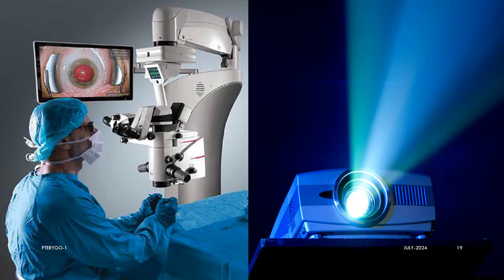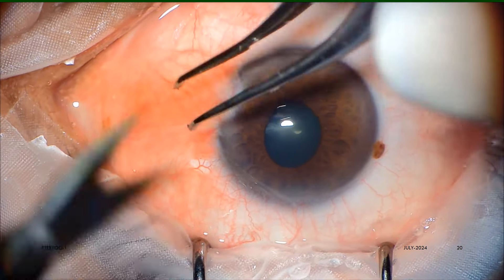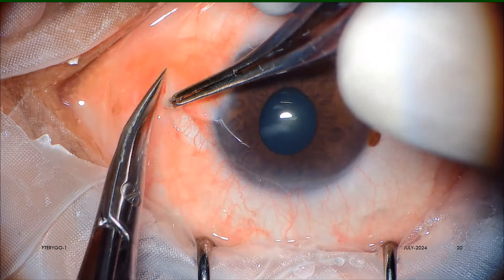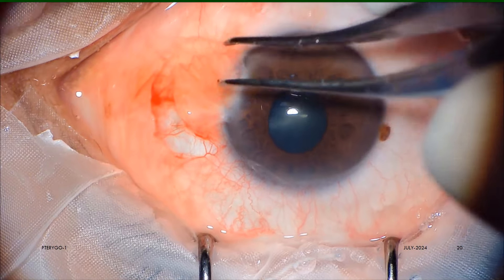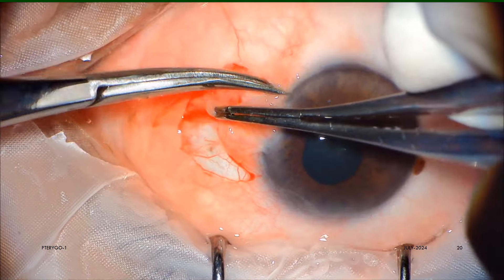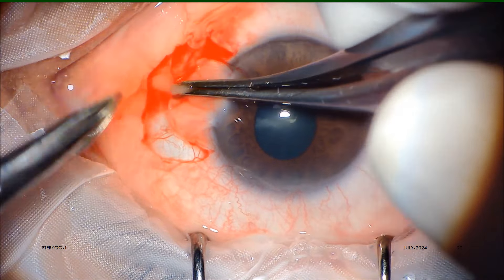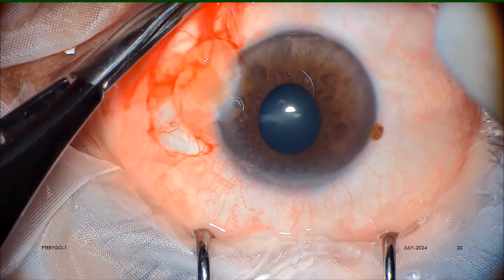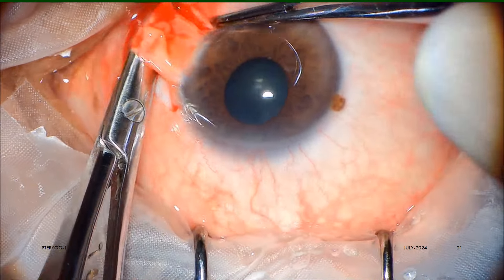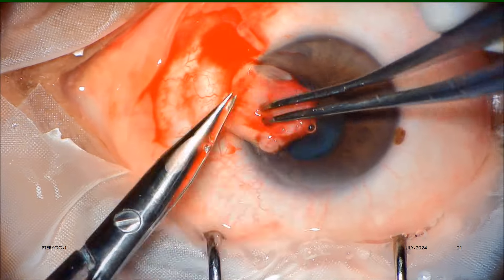Now let us see the Pterygo surgery step by step. First, with the Castroviejo or Westcott scissors, we cut the conjunctiva over the neck and body of the pterygium. The canthal conjunctiva is slightly separated mostly by blunt dissection. Then the closed blades of scissors are passed under the body of pterygium to bluntly separate the band from the sclera, and the band is then cut and reflected on the cornea.